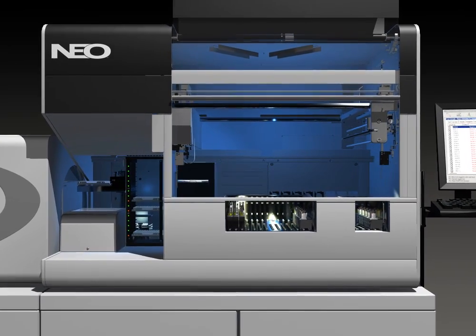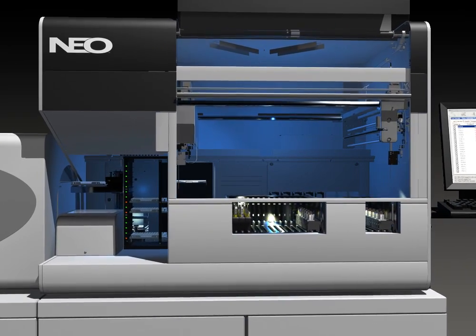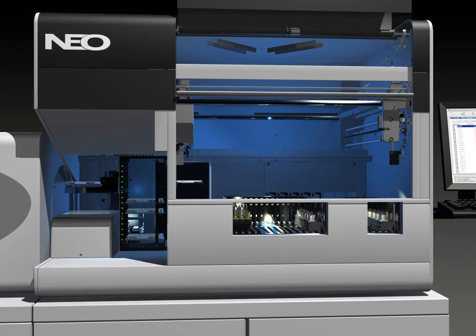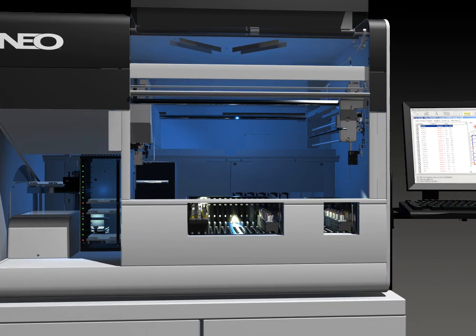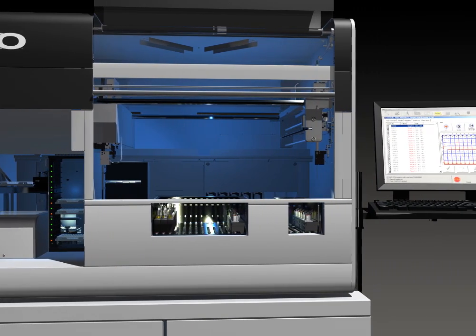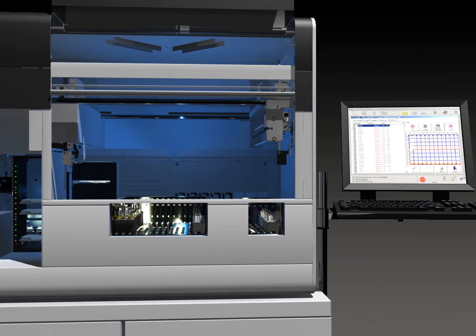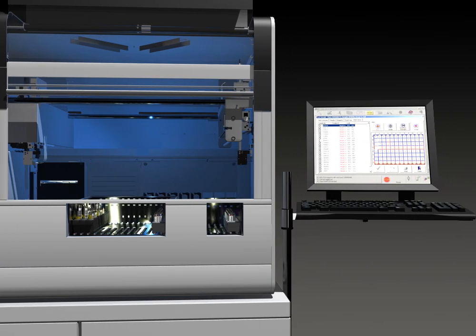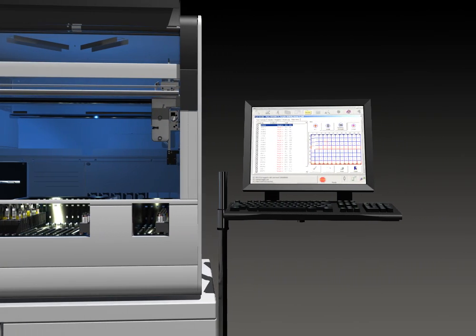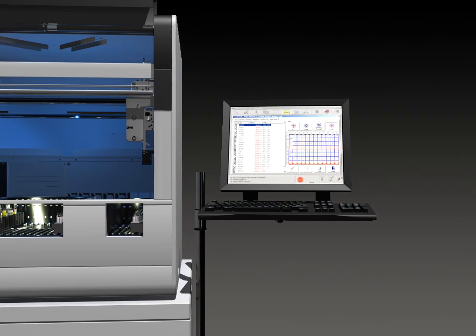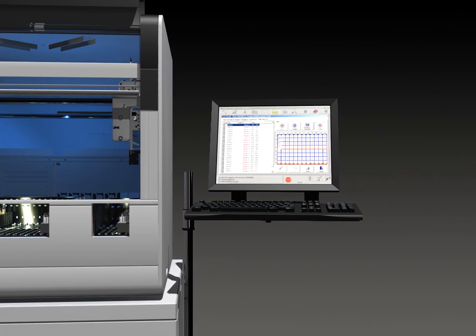With the broadest immunohematology test menu on the market, this instrument will optimize your lab's workflow and operational efficiencies by fully automating more of your work with trusted technologies that provide quality test results.